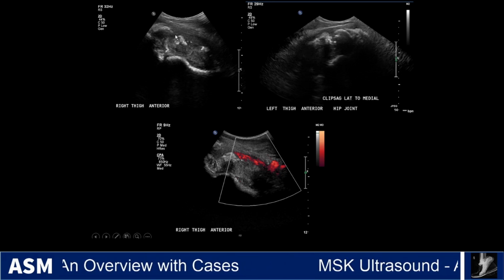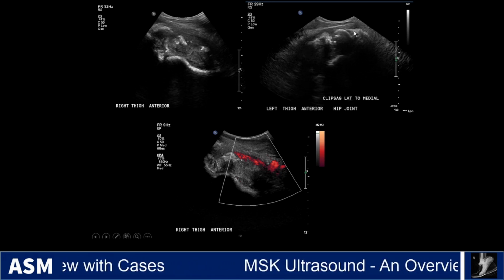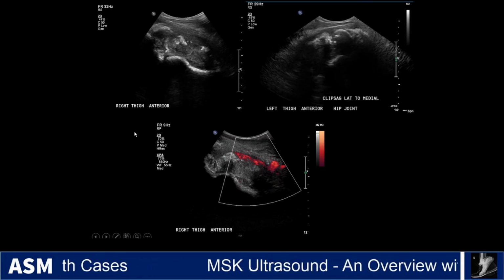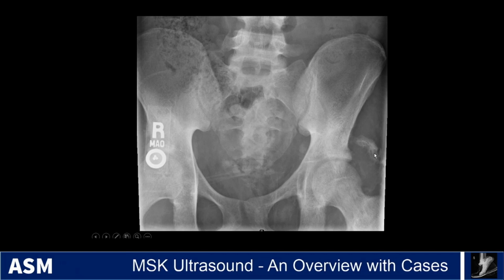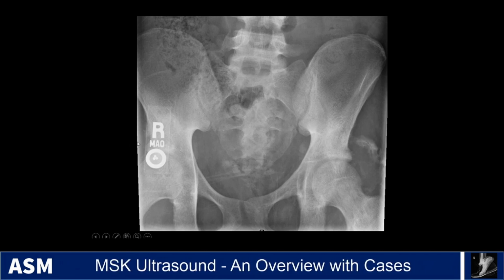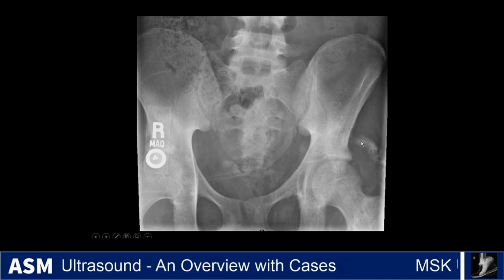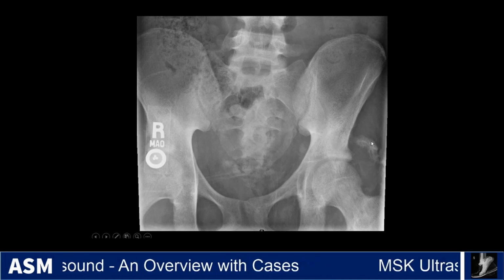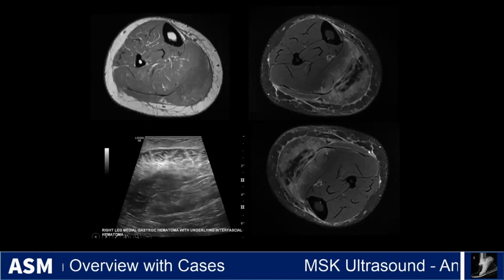So when we came to the ultrasound, we saw all this echogenic material all around the pelvis here with hyperemia, and so we didn't see any fluid to aspirate. So we asked for an x-ray, and sure enough, there was ossification developing. So this is a patient with heterotopic ossification that's early and immature and looks very ominous on MRI, but in this case was not a fluid collection that could be aspirated.